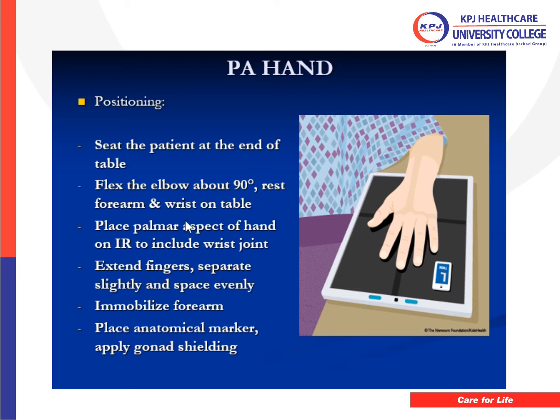Rest the forearm and wrist on the table at the same level as your armpit. Make sure that your table is at the same level as your armpit.